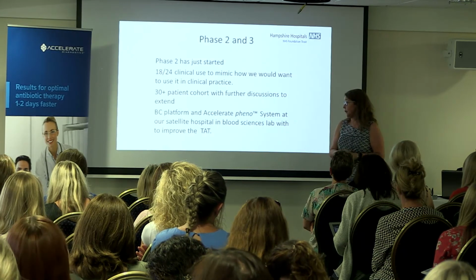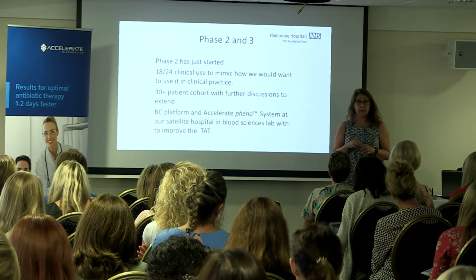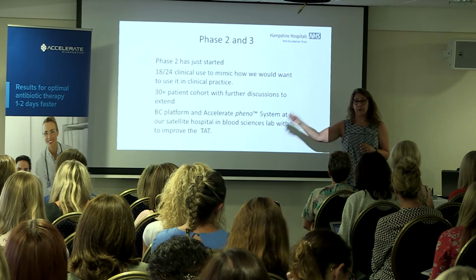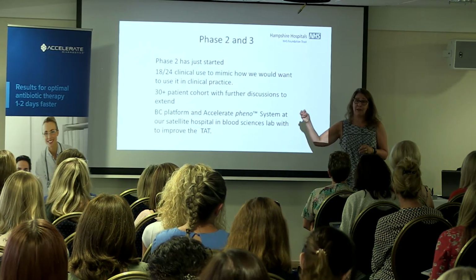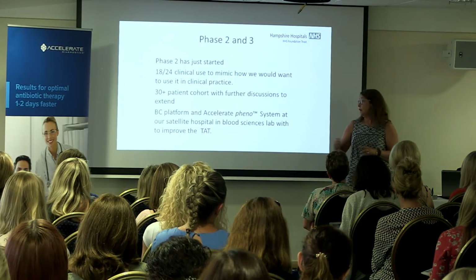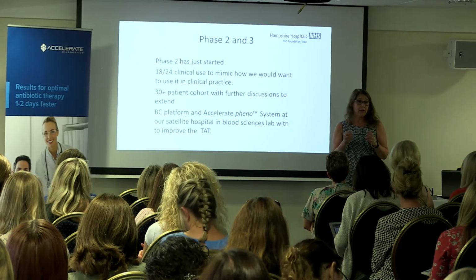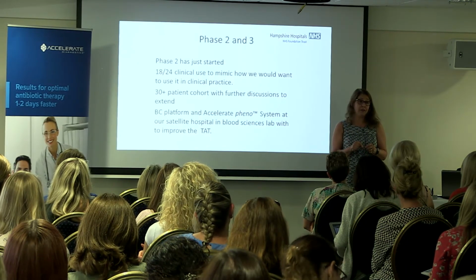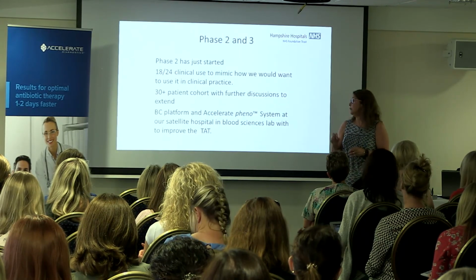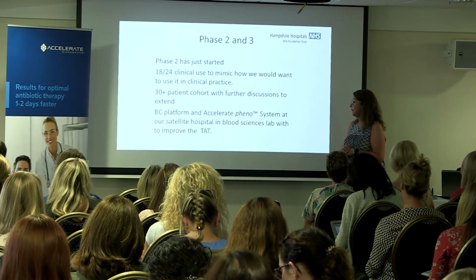The other thing that we want to look at is, like a lot of microbiology labs now, we're a trust with a number of hospitals, and only one hospital has the lab in. So the problem is that for patients who are bacteremic on the other side, there's quite a long delay from blood culture bottles coming from the other site to where the lab is. So we're hoping to put a pheno system in the blood science lab on that other site because it is so easy to use that our biochemists and hematologists are happy to consider inoculating it into the machine.